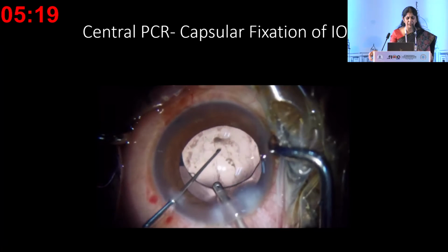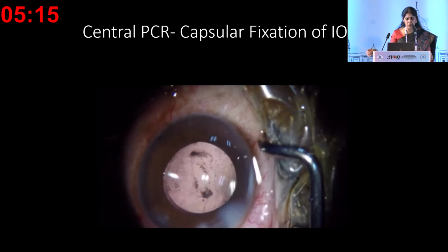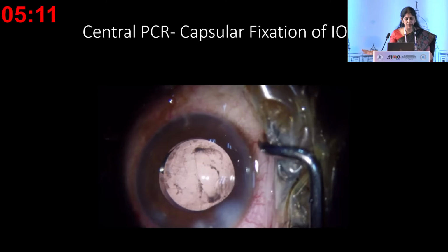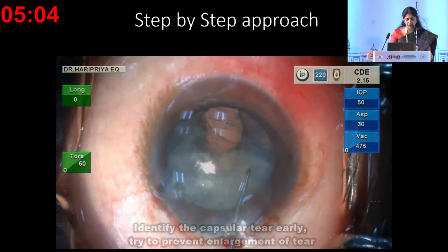Now I'm cleaning up the lens matter which is fibrosed at the edge of the PC tear here. But with these lenses, you can either do a 3-piece in the sulcus or a single piece in the bag. Especially if there's no vitreous loss, this can be an option. Now this is a patient with a PC rent.